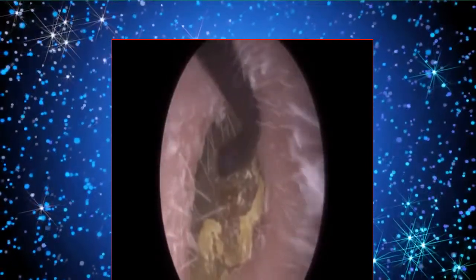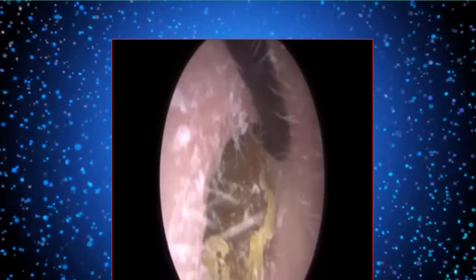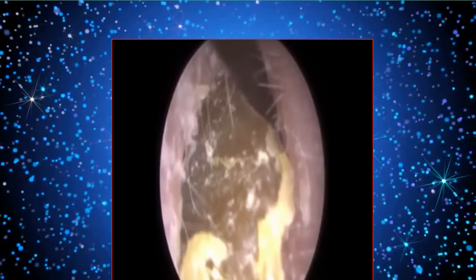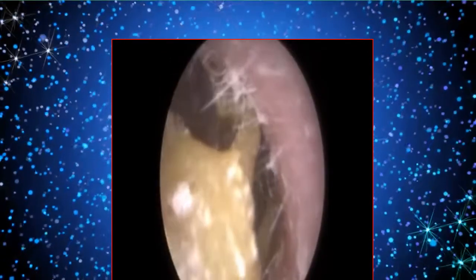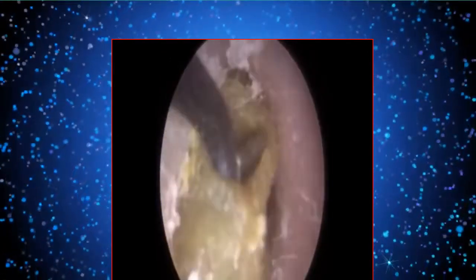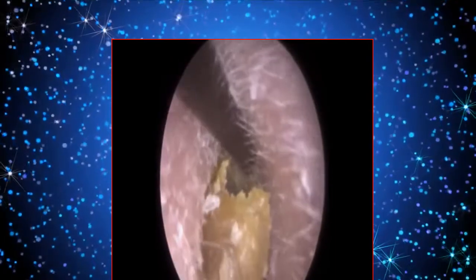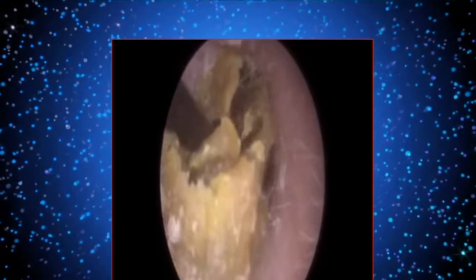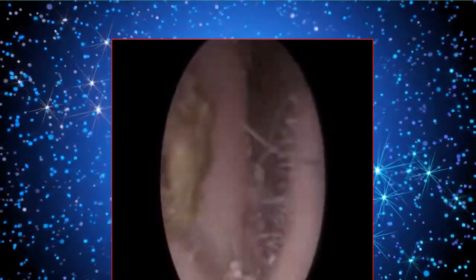I had a patient with bilateral otitis externa. You can see it's very dry and flaky, the skin near the ear canal entrance, and the wax is quite dry and crumbly. I initially used a Zolnir Suction Pro, but because the wax was quite dry it just wasn't getting any suction grip, so I reverted to a St. Bartholomew's earhook, and we're just slowly but surely extracting this out of the ear.